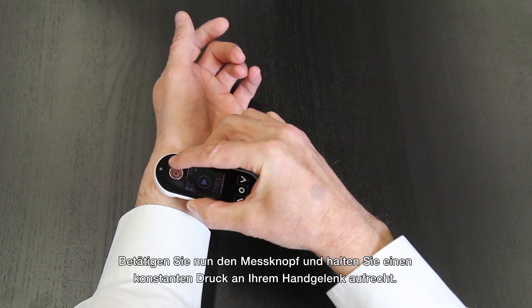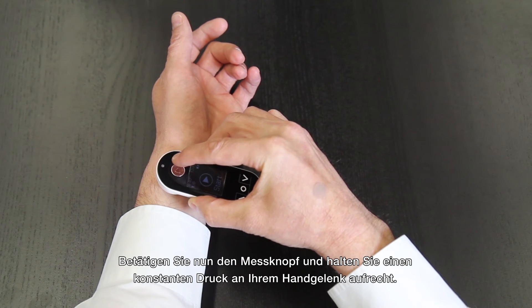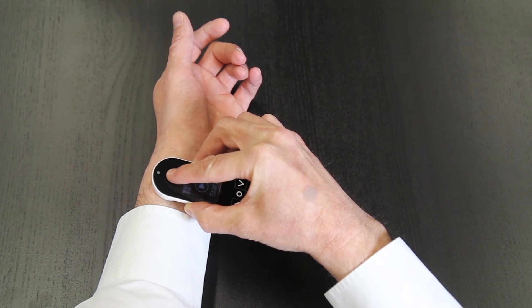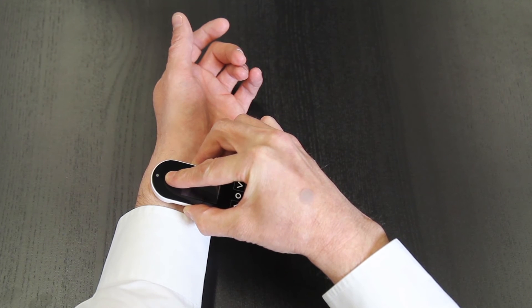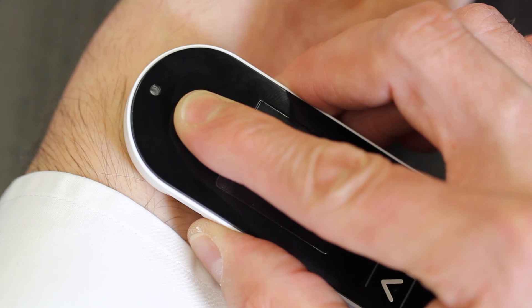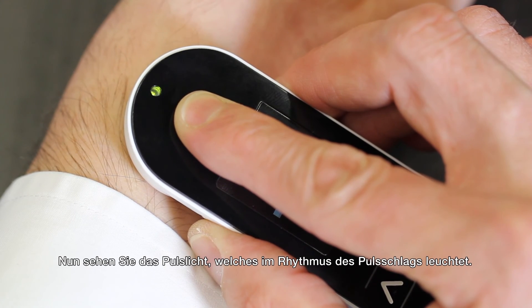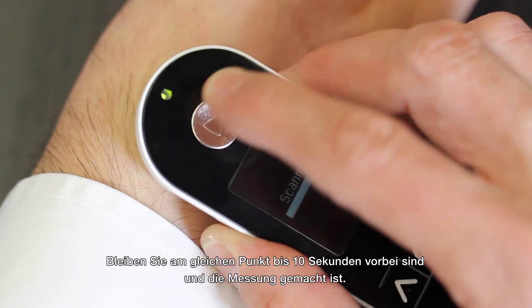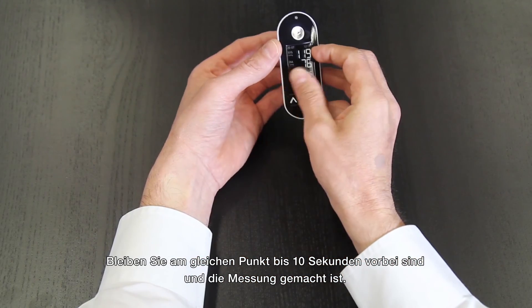Now press the measuring button while you keep the device on that same spot using a constant pressure. You'll see the pulse rate light come on. Keep it there a full 10 seconds to complete the measurement.